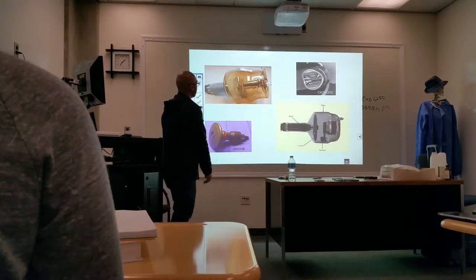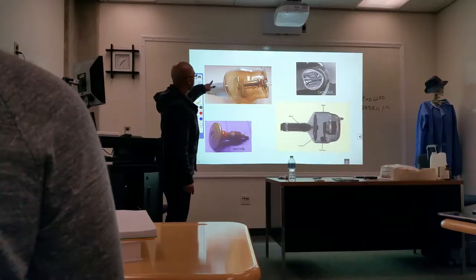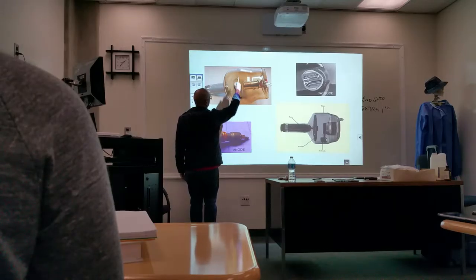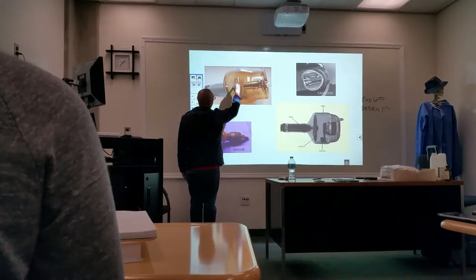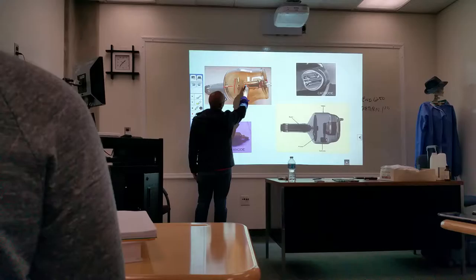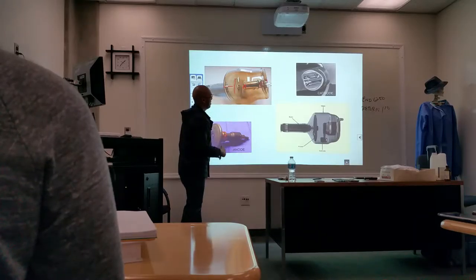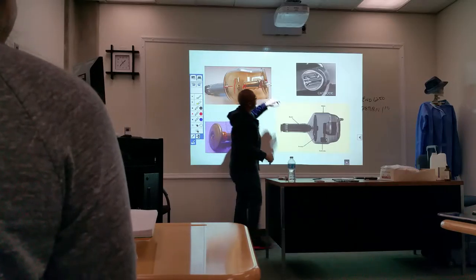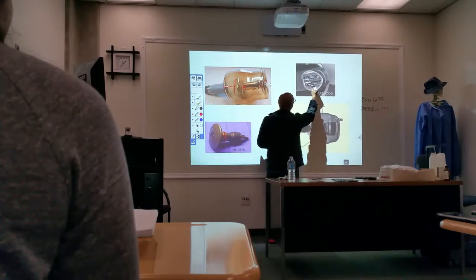All right, so it looks something like this. Okay, you've got your glass housing. Within the glass housing, you have your metal disc or plate, okay, over here. The filaments are going to be located within there, okay? And if we look at this end a little bit closer, this is where you're going to see the two wires. See the two wires?